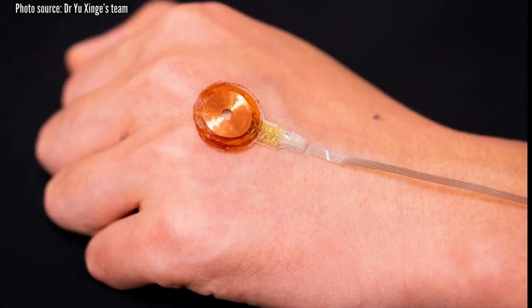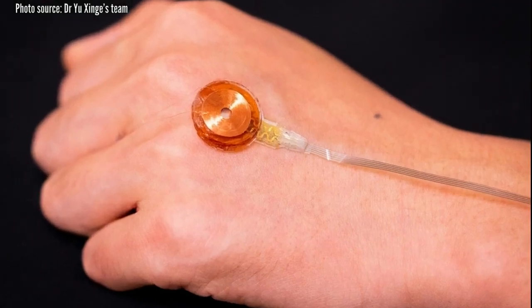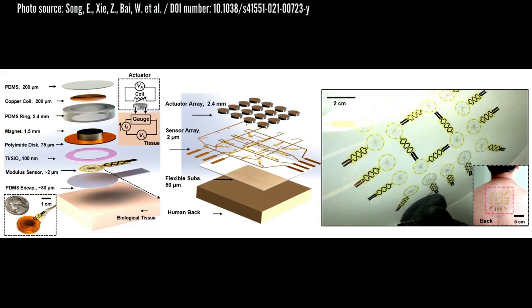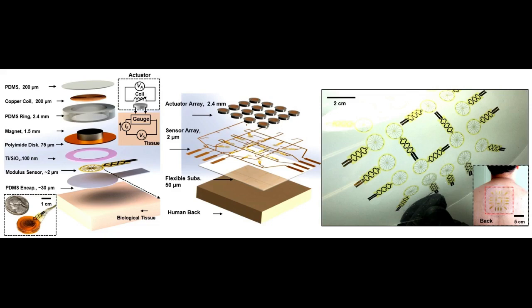By putting a piece of soft strain sensing sheet on the skin, we may be able to detect skin disorders non-invasively and in real time very soon. A research team from City University of Hong Kong has designed a simple electromechanical device that can be used for deep tissue pathology diagnosis, such as psoriasis, in an automated and non-invasive fashion.